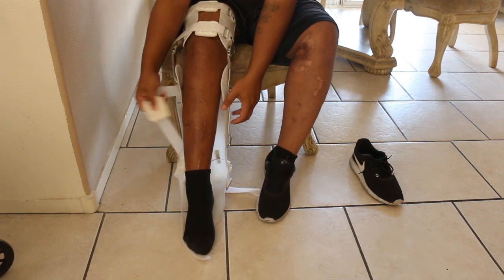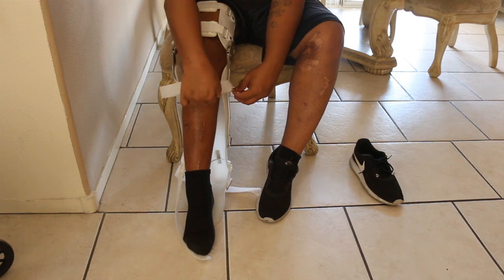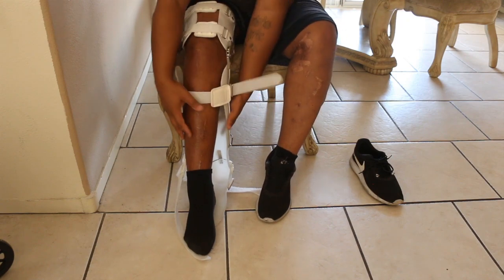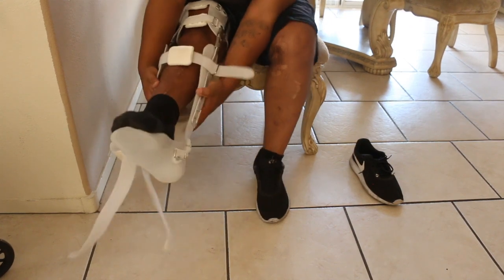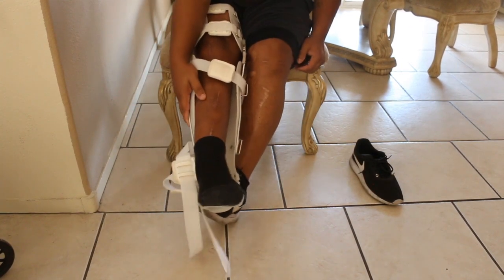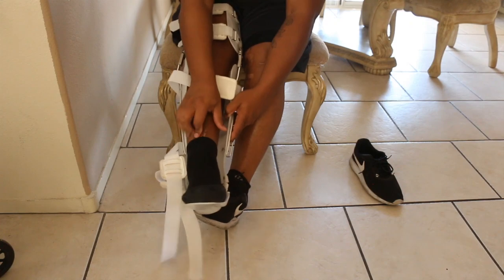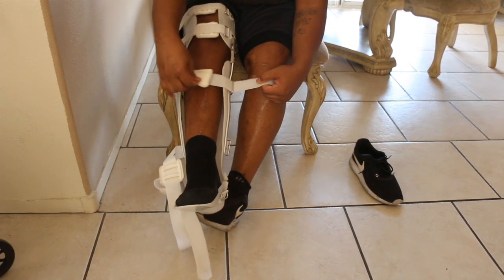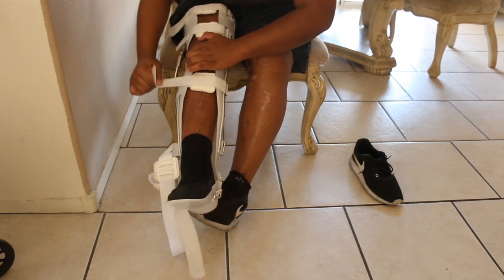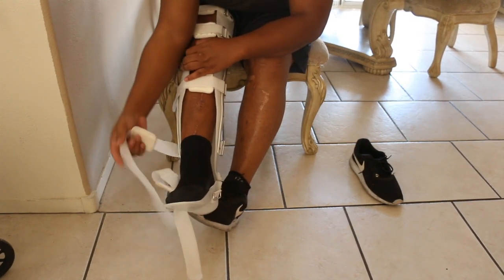The brace is okay. For a person like me — my right leg is maybe 20% mobility at best — if you have more mobility than that, this brace will be great for you. You could probably use it without crutches or a walker. But for a person like me it's just been okay, not phenomenal.